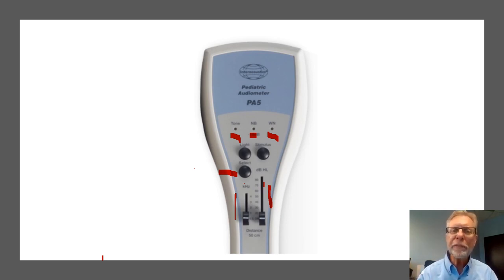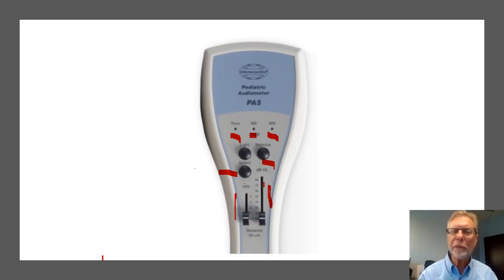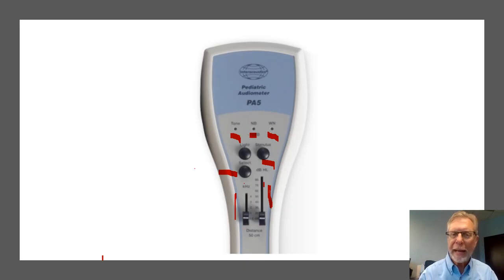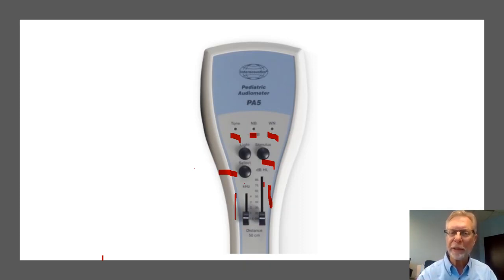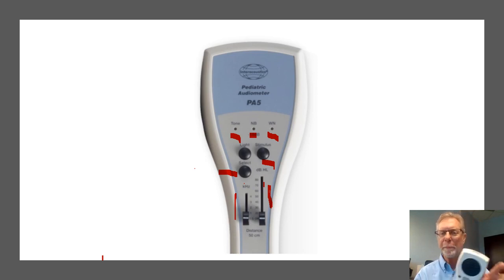And then the final control is this stimulus button right there. And that is what you press to actually apply the stimulus. So let me show you.